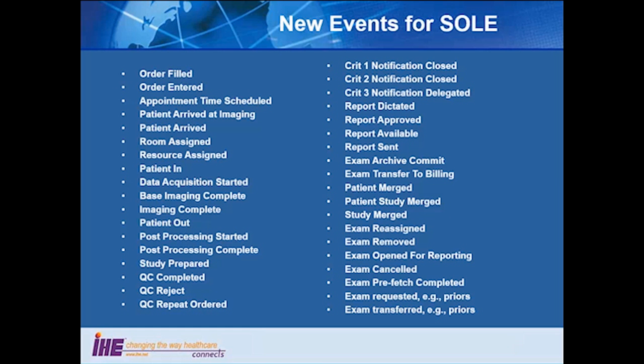Almost every acquisition equipment knows when it starts and stops and what it's doing. If you have QC, QC knows about it. The others around reporting, the reporting tracker usually knows what's going on. As for how to analyze it, we are silent. This is a data delivery, and it delivers it to a repository that can preserve this data for years if you want, and provide it in chunks based on request to people who want to do an analysis of some sort.